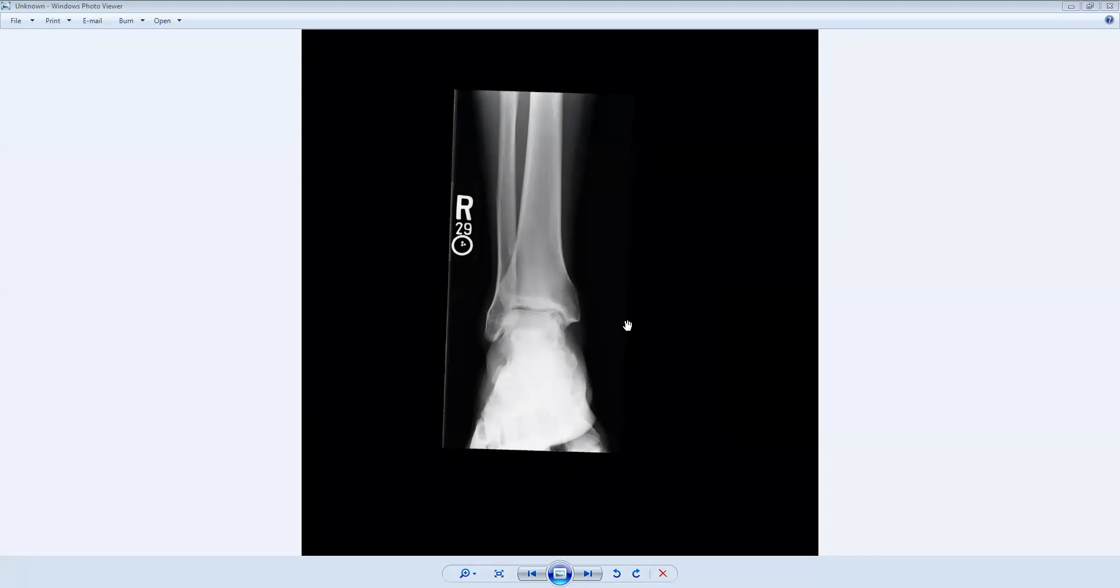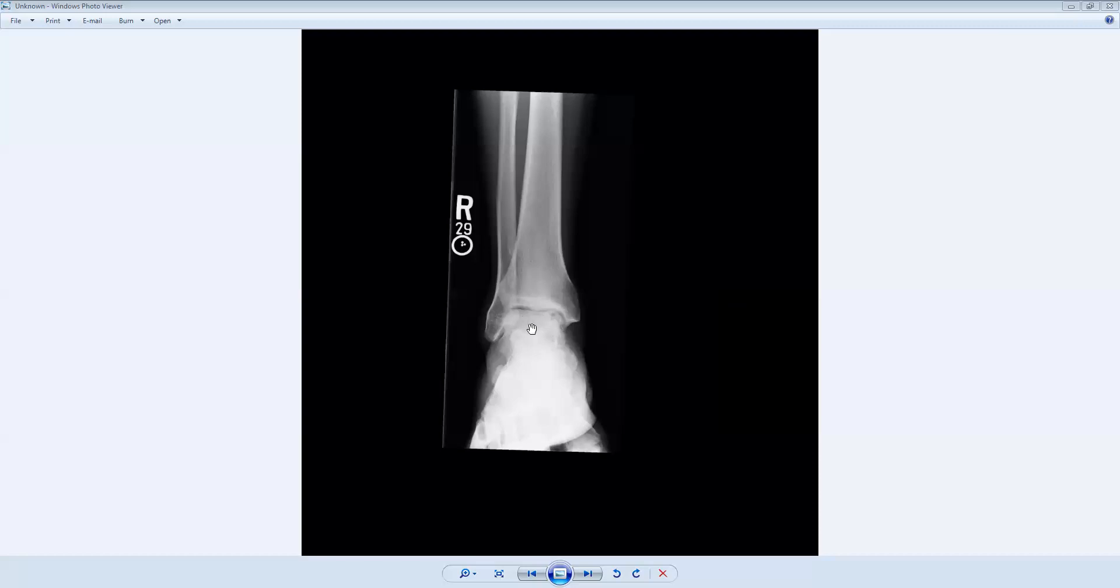The first thing we want to do is make sure there's no fracture. This bone here is the tibia, this here is the fibula, this is the talar dome. The talus articulates with the tibia here at the tibiotalar joint. We can see part of the calcaneus, some of the cuboid, the tarsal bones, and then the metatarsal bones right here.